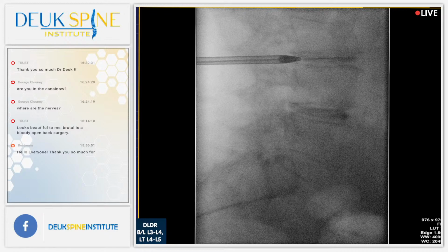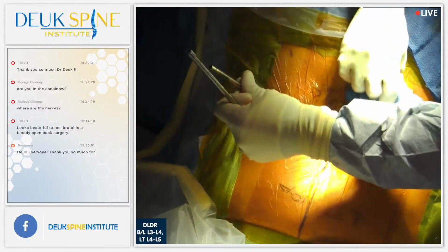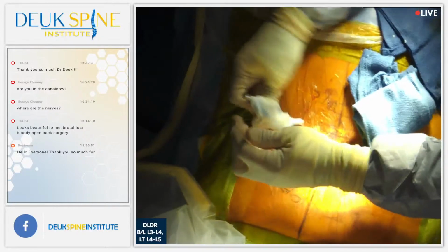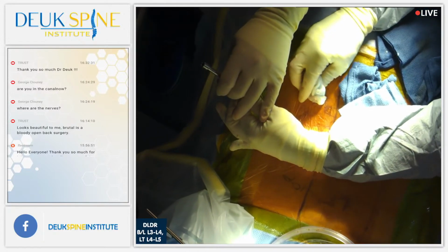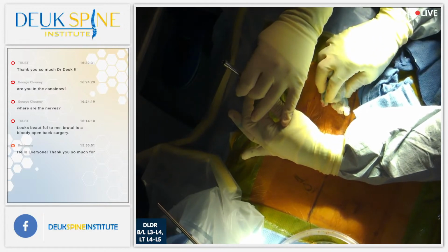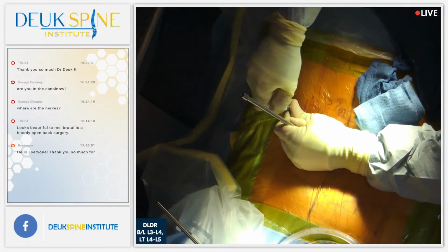See this part right here that everybody hates so much? I'm actually hammering the herniation back into the disc. The bouncing is because you're hitting the herniation. It's so rubbery with all the scar tissue, and it's bouncing you back. I can feel it. So I'm literally pushing the herniation back in. And then I take the herniation pieces out from inside. All right, that's good. Last one, 10 minutes left.